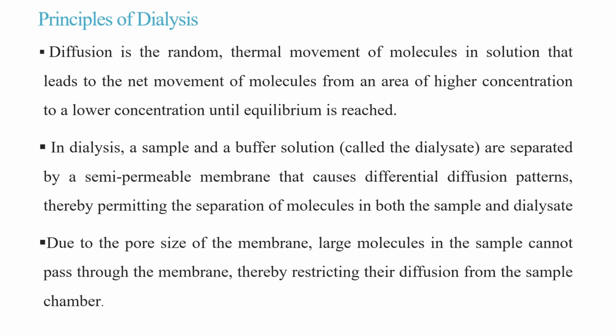Then coming to the principle of dialysis: diffusion is the random thermal movement of molecules in a solution that leads to the net movement of molecules from an area of higher concentration to an area of lower concentration until equilibrium is reached.